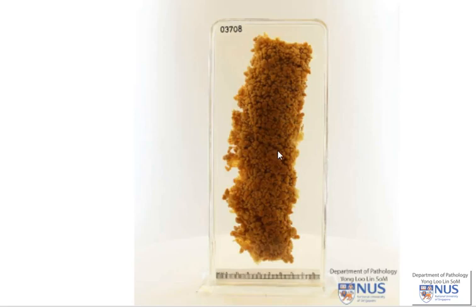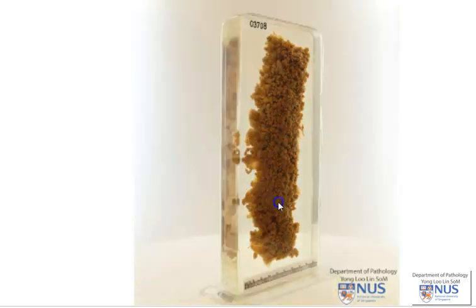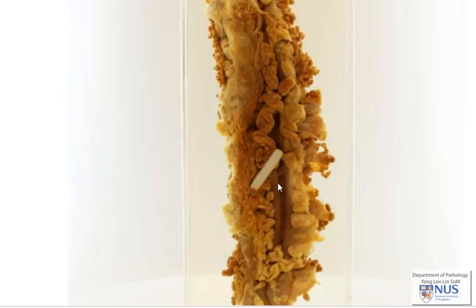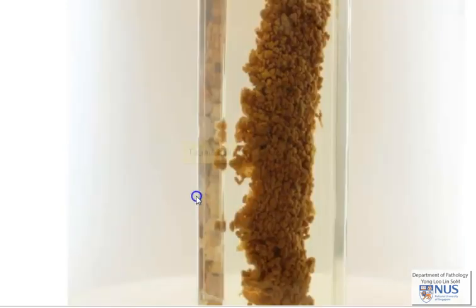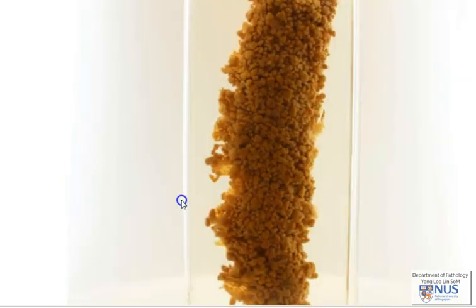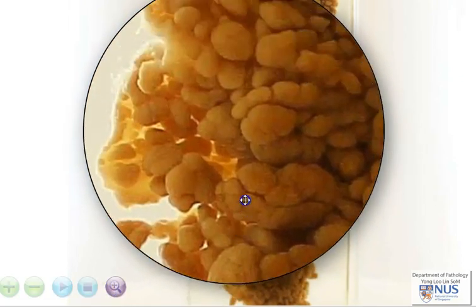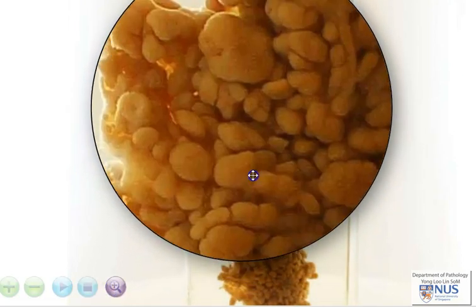This is a segment of large bowel and we're looking at the mucosal surface, which is extremely abnormal. We can turn this around to show how we can tell this is large bowel - on the serosal surface the tenea coli are visible. Taking a closer look at the mucosa, you'll note that it is carpeted with thousands of polyps.